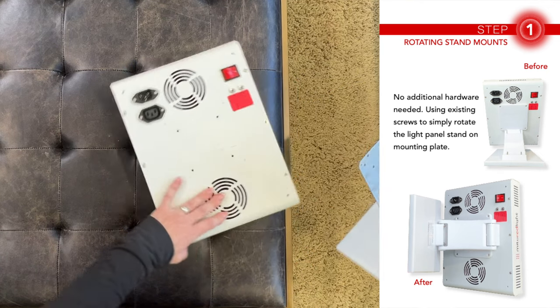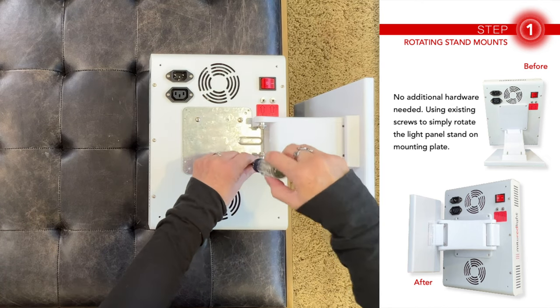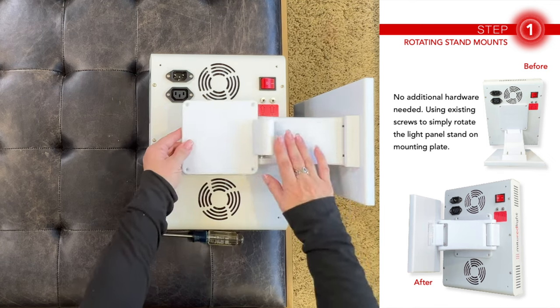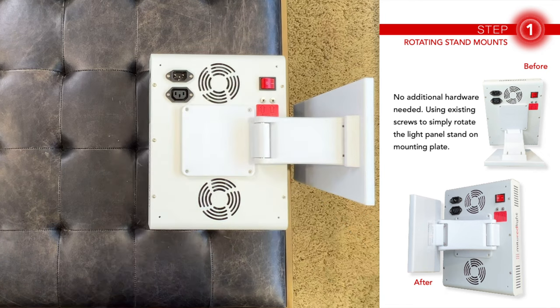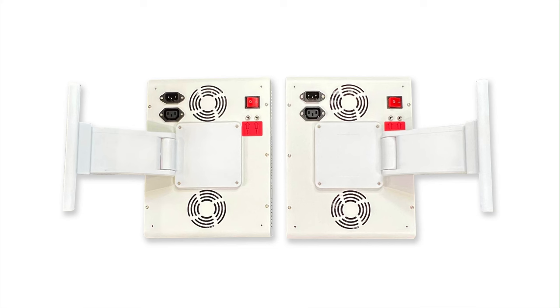Rotate the light panel and reattach the base so it's off to the right side towards the power switch. Put the plastic cover back on going straight down, and put all four of its screws back in. This one will be the left-facing panel. The right-facing panel will have the stand coming off the opposite side where the cords plug in. When you're done with the panels side-by-side, this is how they should look.